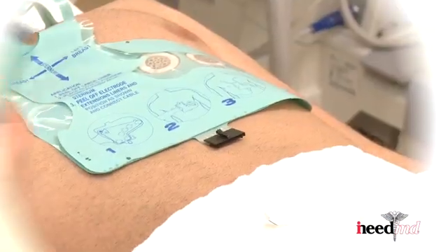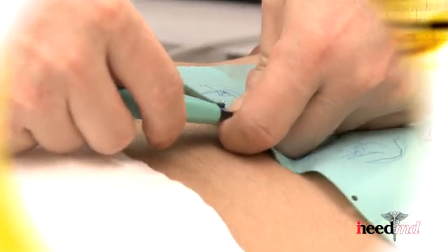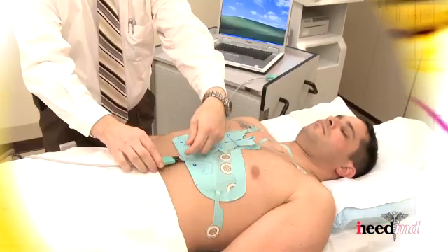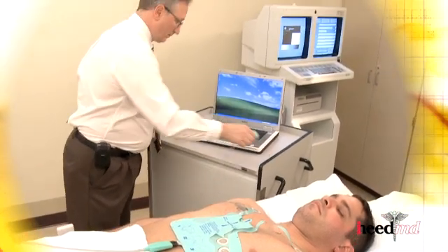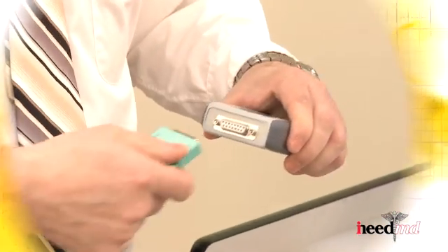Connect the glove to the iNeedMD cable until the glove and the cable are latched. Place the other end of the cable, the DB15, into the QRS card.